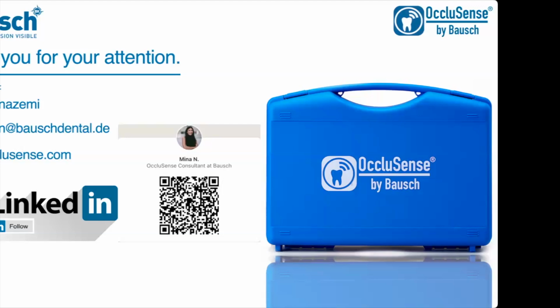RP going into ICP tight, you'd have to explain a little bit more. I'm not sure what you mean. And how much pressure a normal occlusion should have. Yeah, you'd need to specify this as well. What do you mean by normal occlusion? Do you mean the textbook occlusion? Because OccluSense is quite a relative process of occlusion control. So it will give you a relative amount of pressure that is being applied, but it will not give you a specific value for the pressure.